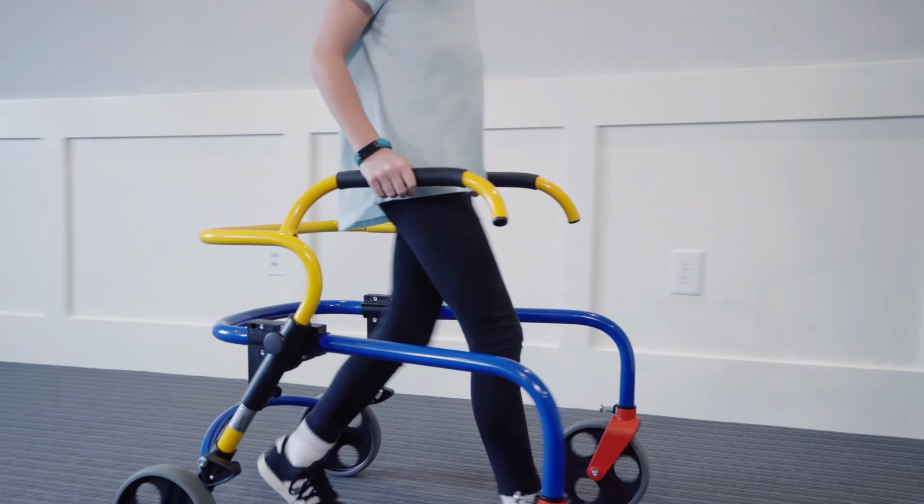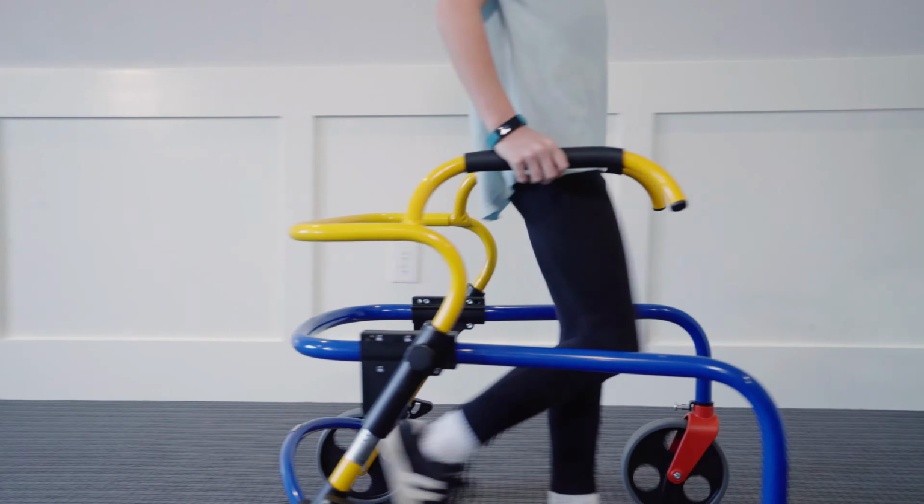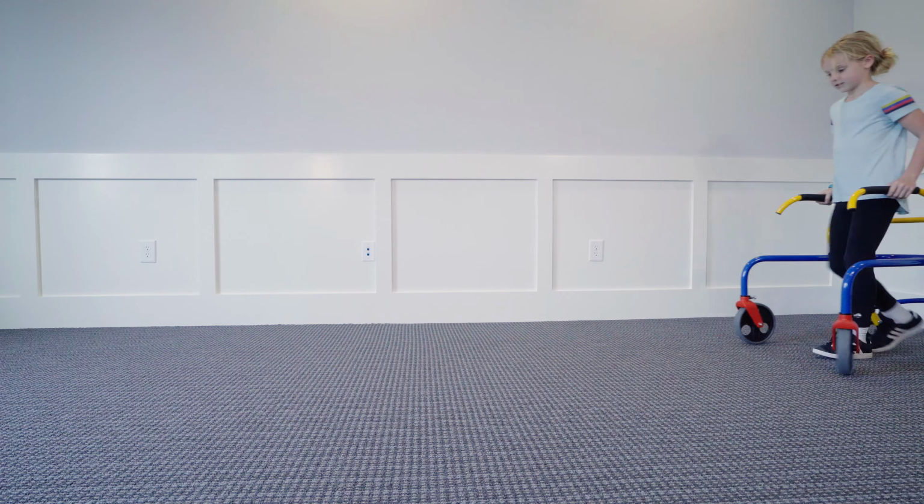One thing with the reverse walkers that is great is that the individual that's using them has full access to their environment. And so when they walk up to a car door, when they walk up to a table, or to eat, or to do anything, you're able to access it.